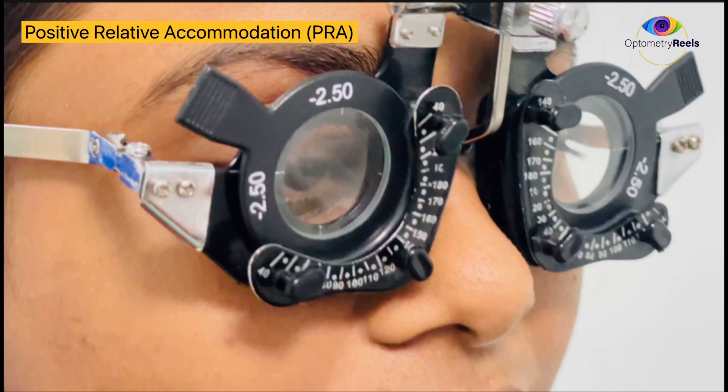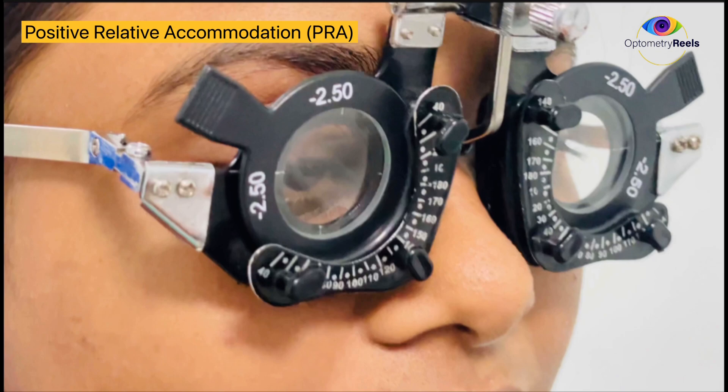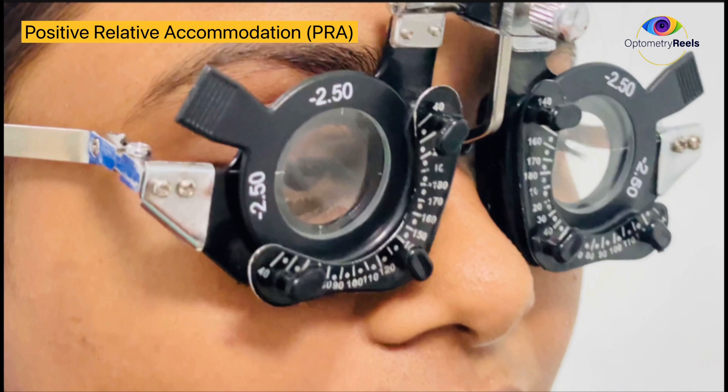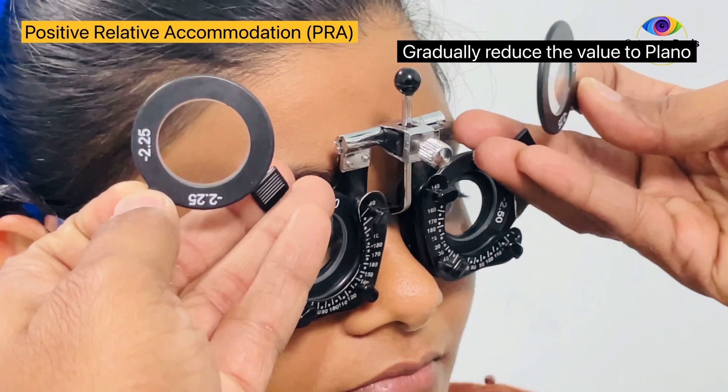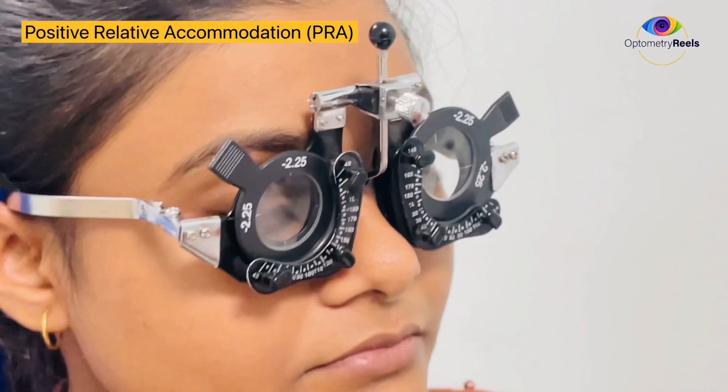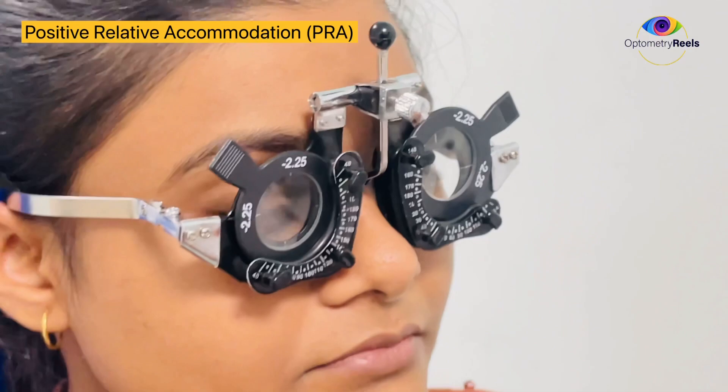The normal expected value for PRA is minus 2.5 diopters. You may get a value even higher than 2.5, but if you are getting values lesser than 2.5 it may indicate binocular vision anomalies, especially vergence and accommodative problems. Now I'll reduce these values — you have to remove the higher power lens first and insert the lens with lesser power, reducing from 2.5 down to 0.